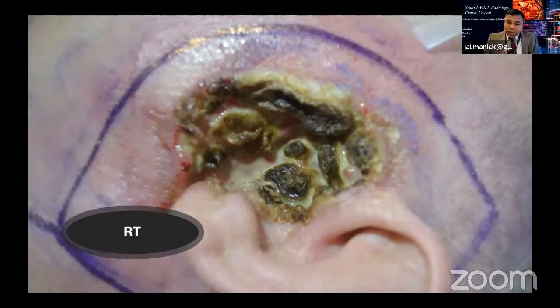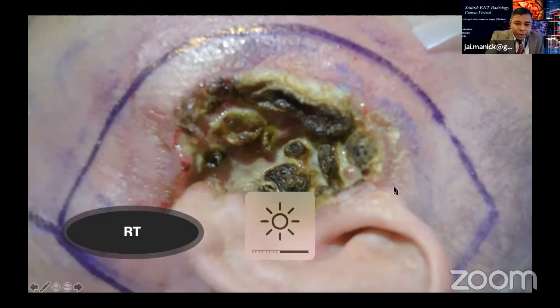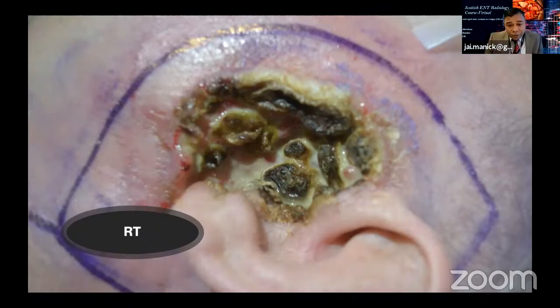So in this particular case, you need to use your radiographic eyes, a sheet in front of your eye. What are the structures in the deep? For example, starting with the TMJ, you want to know whether the TMJ is involved. The next step is possibly the parapharyngeal space. Above, it's connected to the foramen ovale, to the brain, then the maxillary artery, zygomatic bone, masseter muscles, and the neck nodes. At the lower end, you have neck nodes and the IJV. Quite a few structures are involved in that area. That's what your thought process should be.